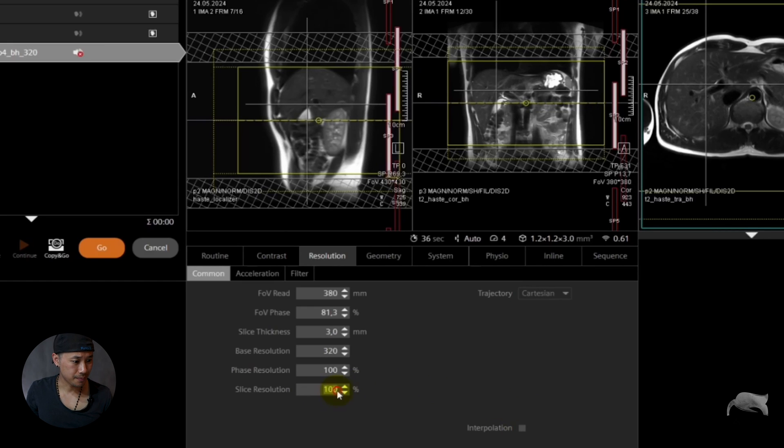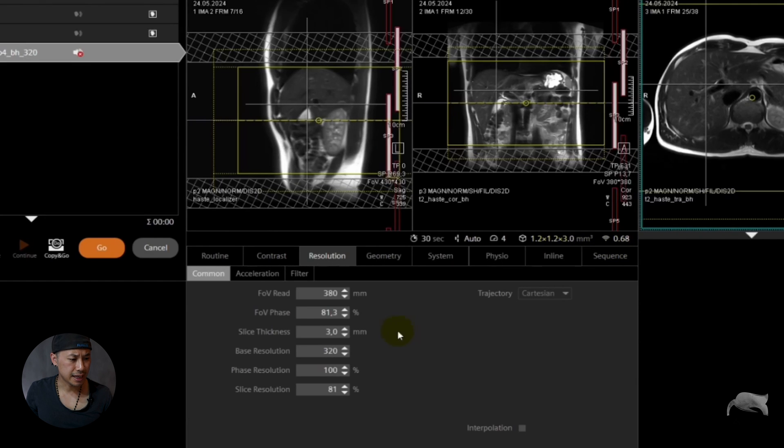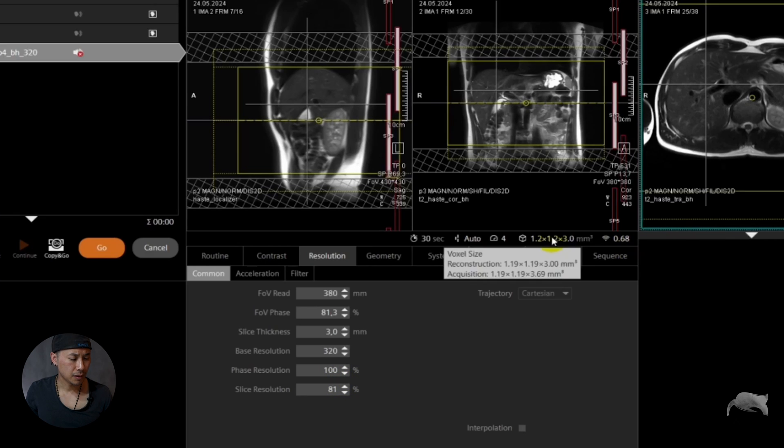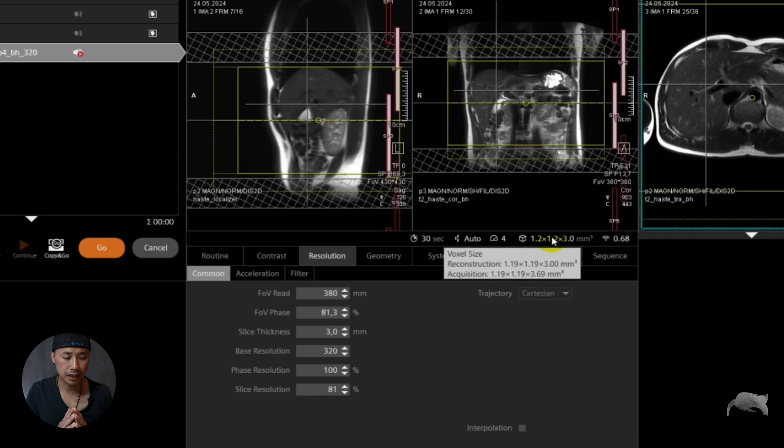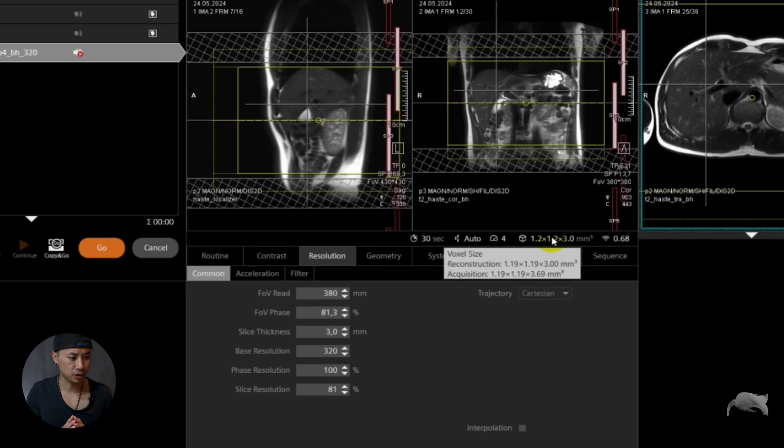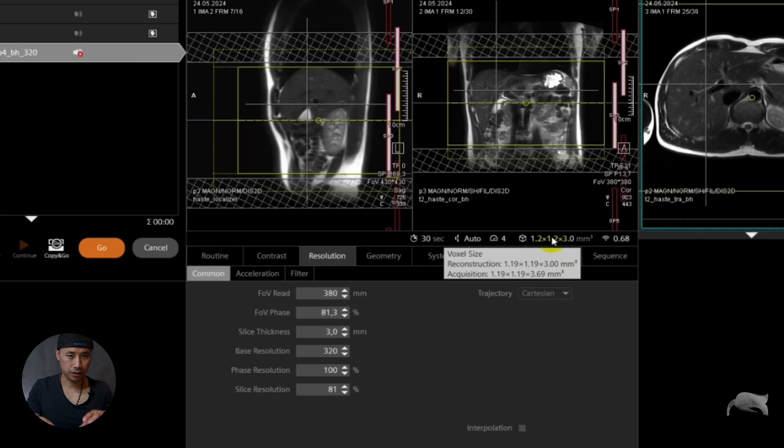So let's choose 80%. So we have now 3 millimeter and we choose 80%, we gain a little bit SNR and now we are acquiring 3.69 millimeter interpolated down to 3 millimeter.